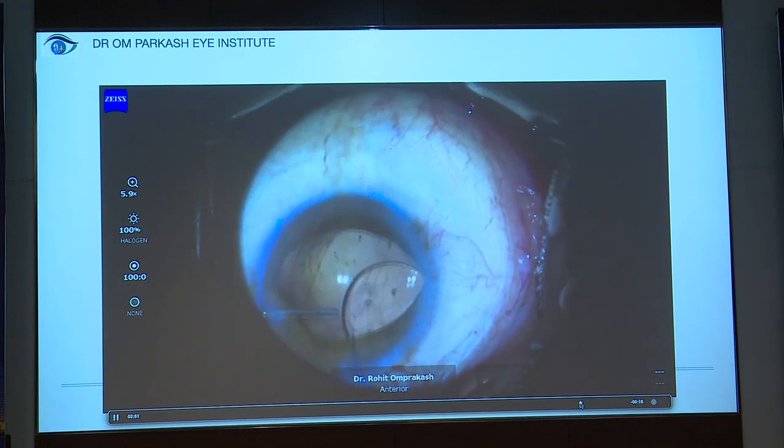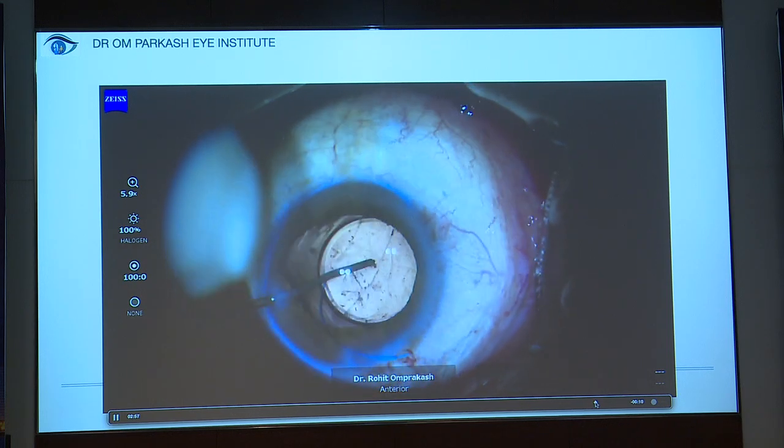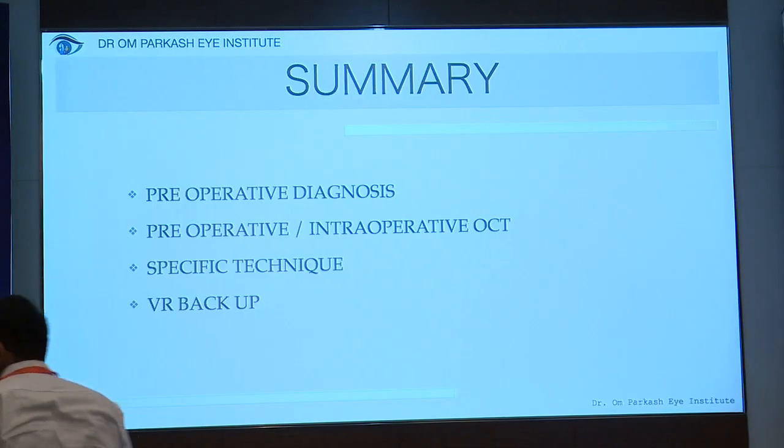Here it was an open posterior capsule with no rounding off, because that was not possible, and the case was duly completed. Thank you very much. So flax I will not be dealing in because of paucity of time. So basically this I'm not showing.